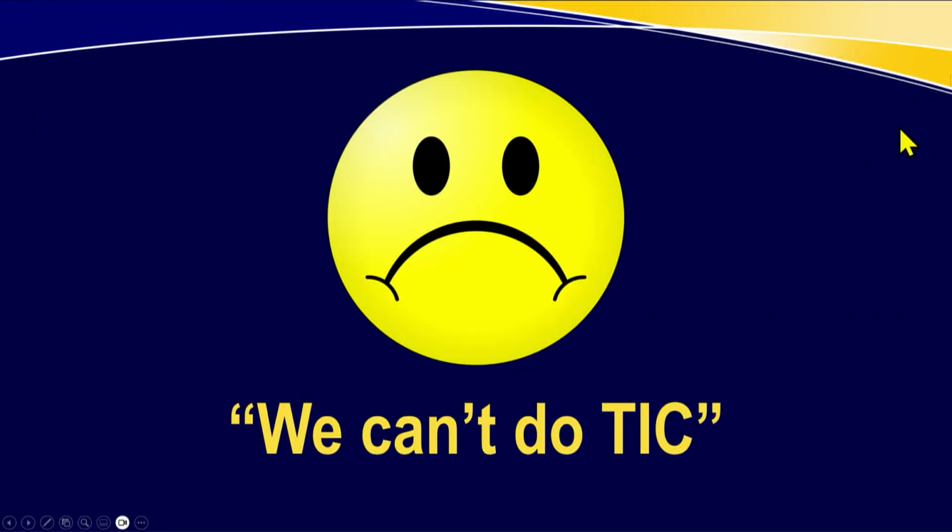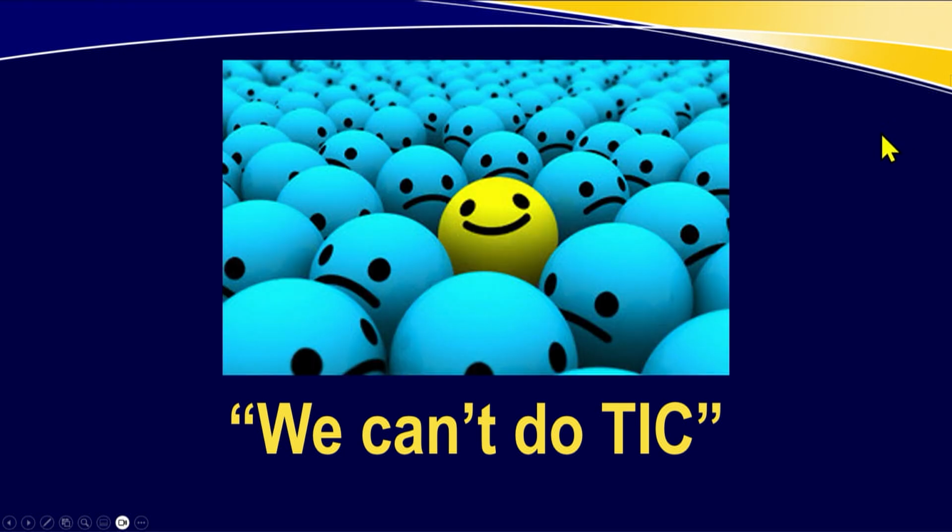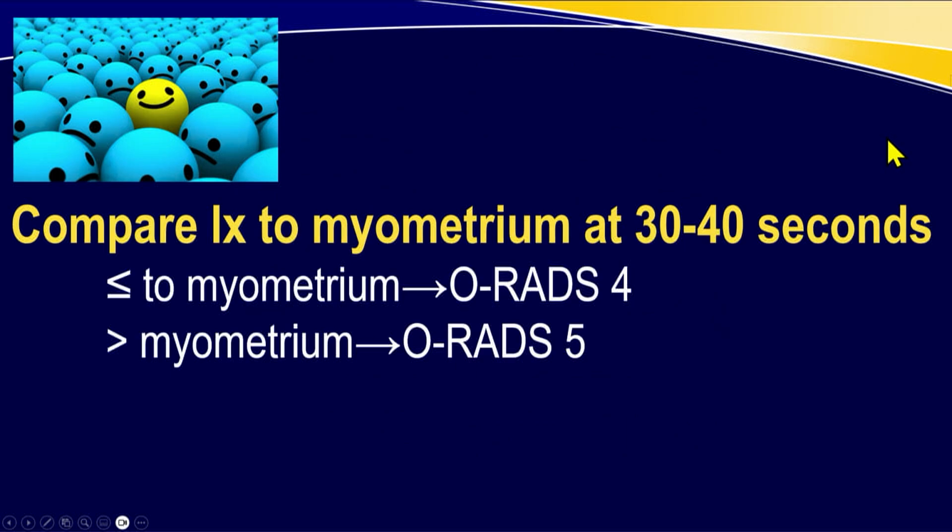But what if you raise your hand and say, well, that's really great, Susan, but either we don't have that capability to do those time intensity curves, or that takes time and we're uncomfortable in our outpatient office, we're just not going to do it. No worries. While not maybe as good, you can certainly get away with pre and post contrast imaging, and I think that's pretty de rigueur for most of us.